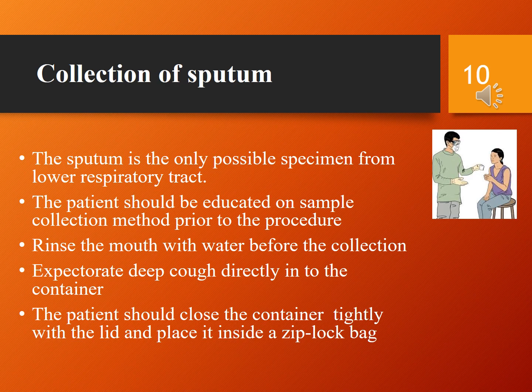Rinse the mouth with water before the collection. Expectorate a deep cough directly into the container. The patient should close the container tightly with the lid and place it inside a Ziploc bag.